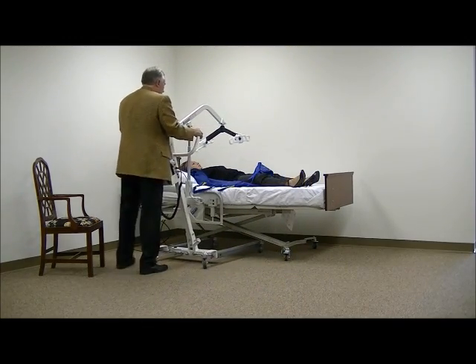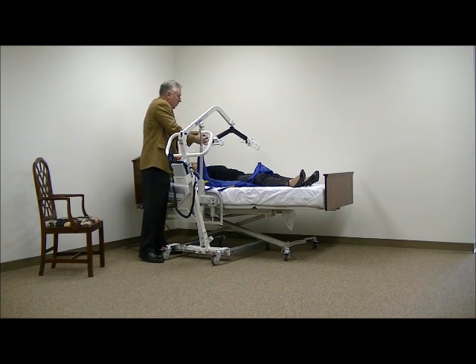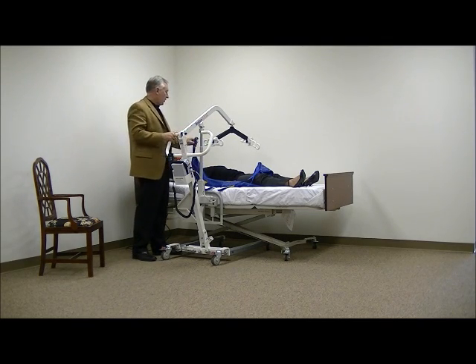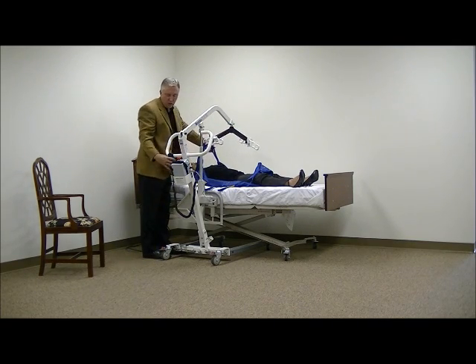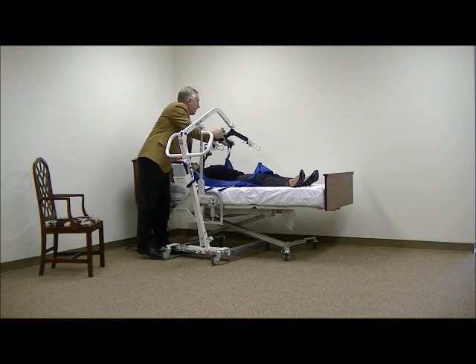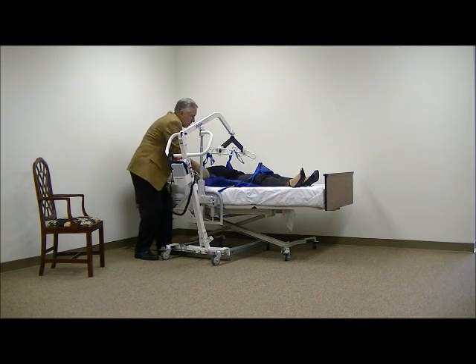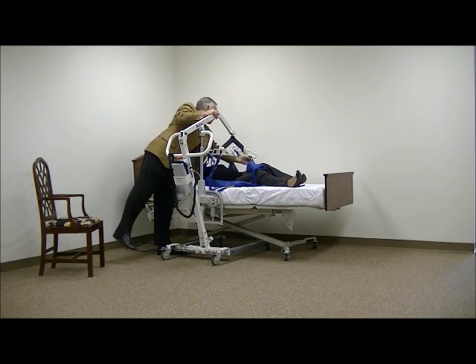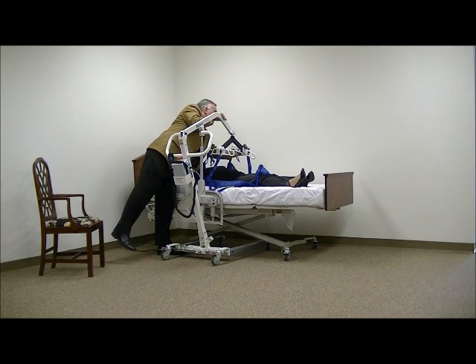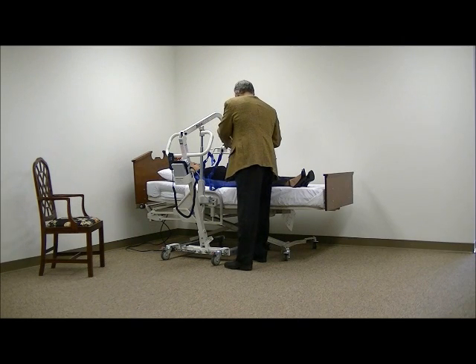Approach the patient with the lift. Connect the sling to the hanger bar. Now in this case, we're going to want the patient to sit up. So if we want the patient to sit up, we're going to connect the shoulders at their lowest point. We have to lower this down a little bit. The middle section at its lowest point. And the legs at the lowest point.